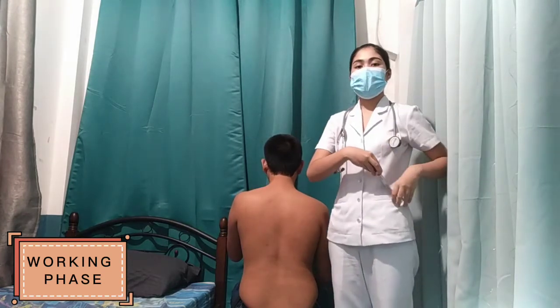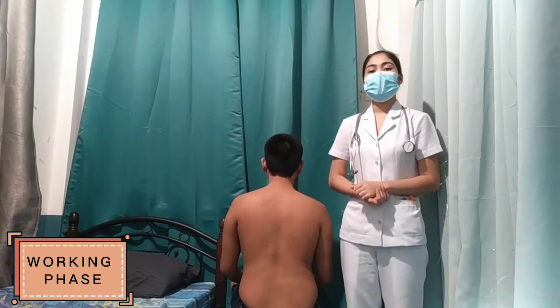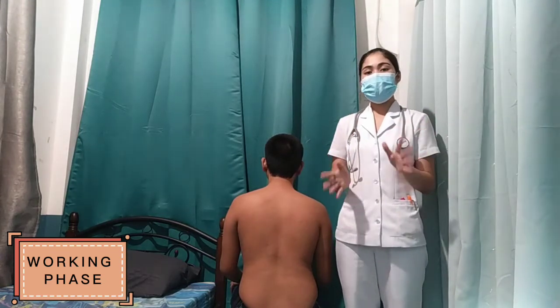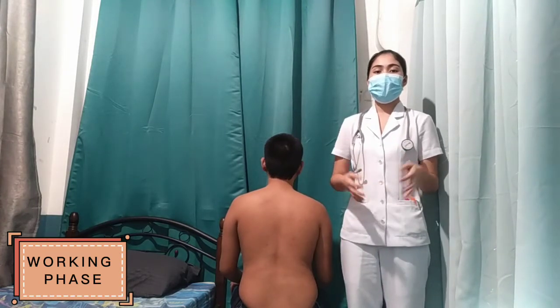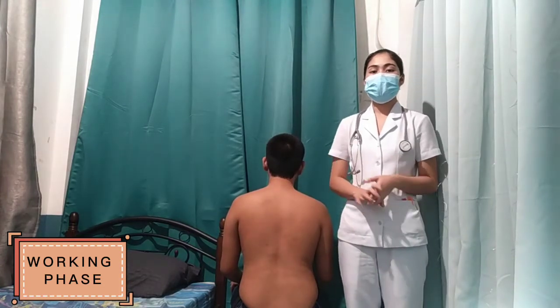Okay, next I am going to auscultate for breath sounds. First, we have to place the diaphragm of the stethoscope firmly and directly on the posterior chest wall at the apex of the lung at C7. And then we also have to ask the client to breathe deeply through the mouth for each area of auscultation and use the systematic ladder pattern used in percussion.